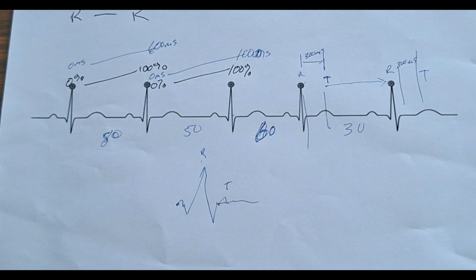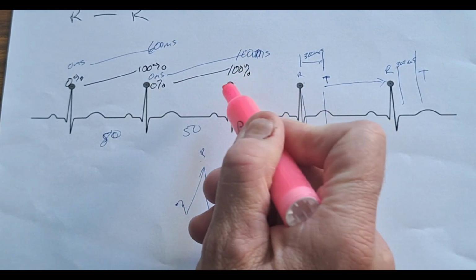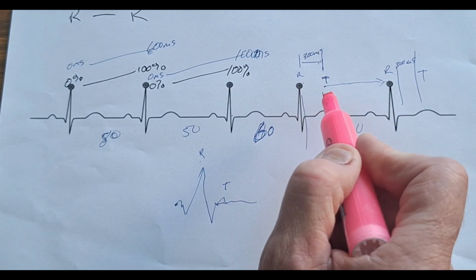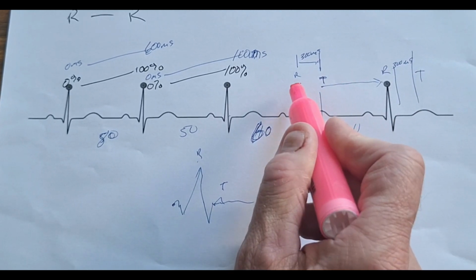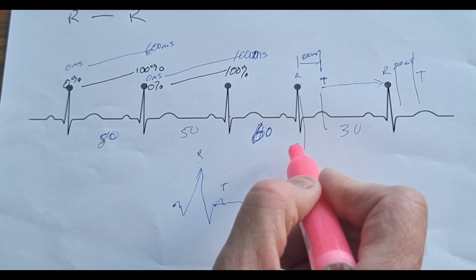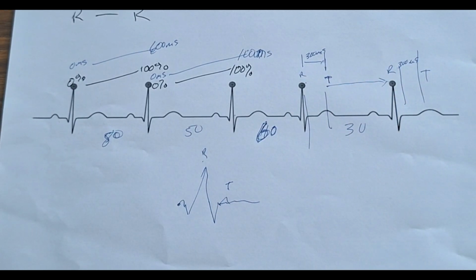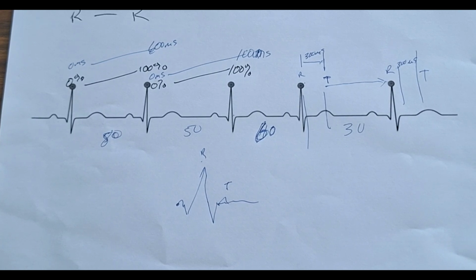So for this video, recap. R wave, super important. Make sure your tags are on. Know that your T wave is the second most important wave. The reason why is because our R to our T is stationary in time. Time changes from the T to the next R. This will matter when we start setting up protocols and determining where we're going to place radiation.